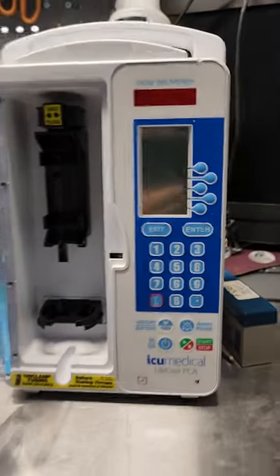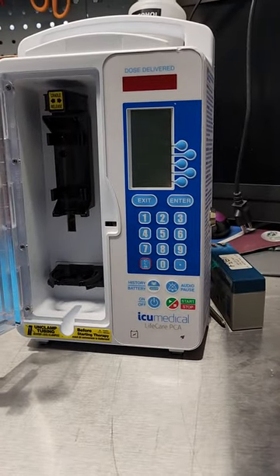Okay guys, today we're gonna take a look at the ICU Medical Life Care PCA. This device is being a little bit of a pain, so let's go ahead and take a look and maybe you guys can help me out with the little problem that I'm having.